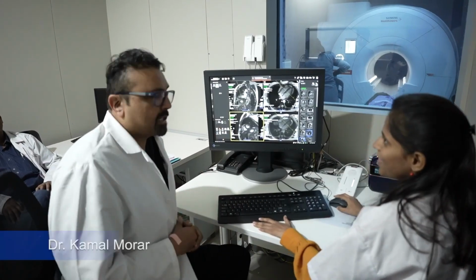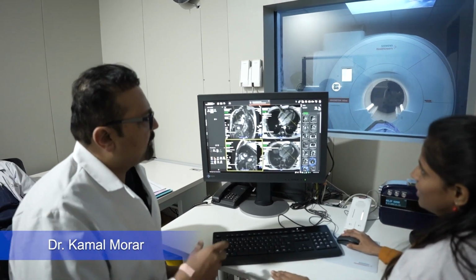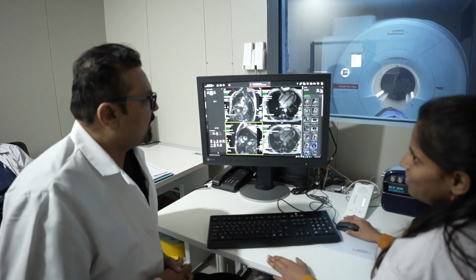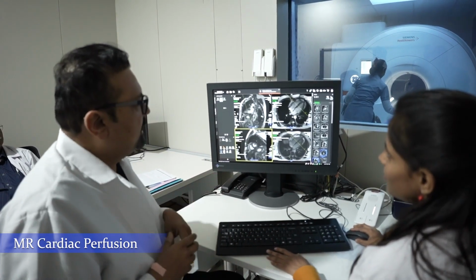Okay, so we just got done with the CT scan. We looked at what my heart vessels look like. Things are looking different. It didn't look like there was much as far as a major blockage or anything. The MRI, this is what the MRI is going to show. It's going to show us something completely different.